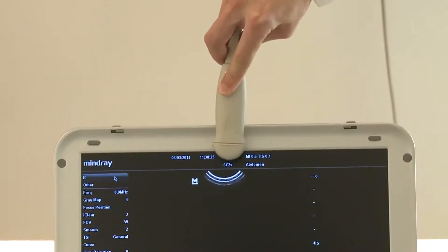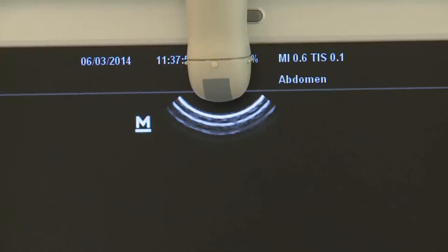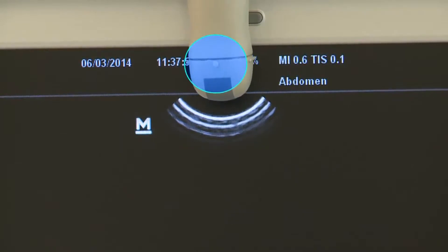The probe indicator M corresponds to the position of the probe mark. Make sure the probe mark always faces the animal's head and the operator's left side.